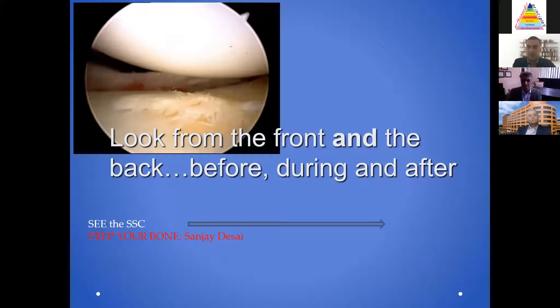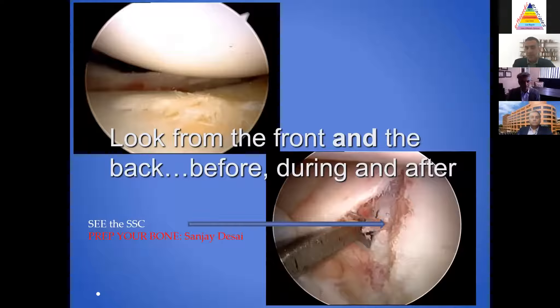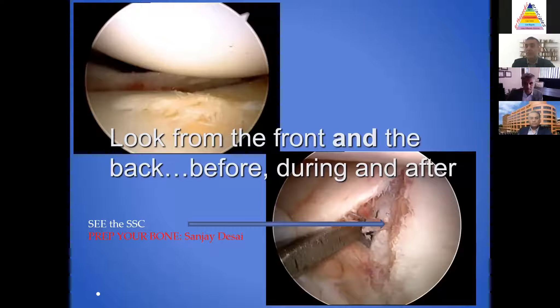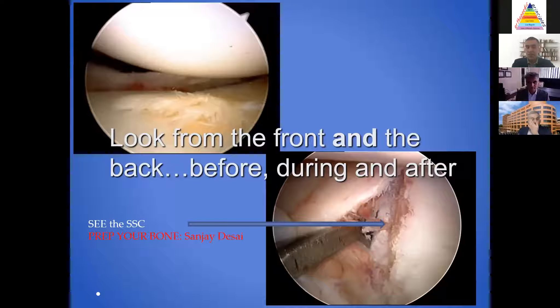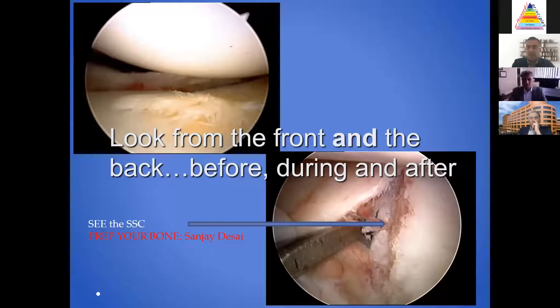I want to look from the front and the back during and after surgery. As a consequence, I'm going to place three cannulas in a typical case — anterior inferior, anterior superior, and posterior. Placing cannulas allows me to move from front to back without thinking twice. You can do this cannula-free or through one cannula, but that's the least expensive portion of this operation. I just don't want to be encumbered or limited by my view.